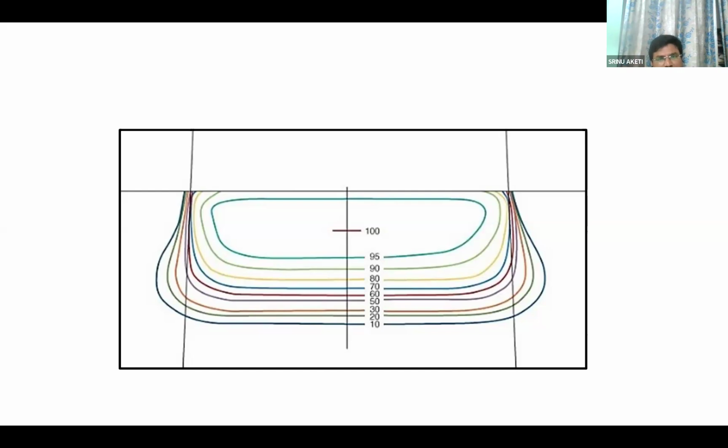In photons, how much margin will you give around the tumor? Hardly 7 mm to 1 centimeter. Am I right? Yes, sir. But in the case of electrons, you give somewhat bigger. The reason is that the higher value isodose lines are contracted, compressed. That is the reason you have to use bigger fields. Somewhat bigger, not too much.